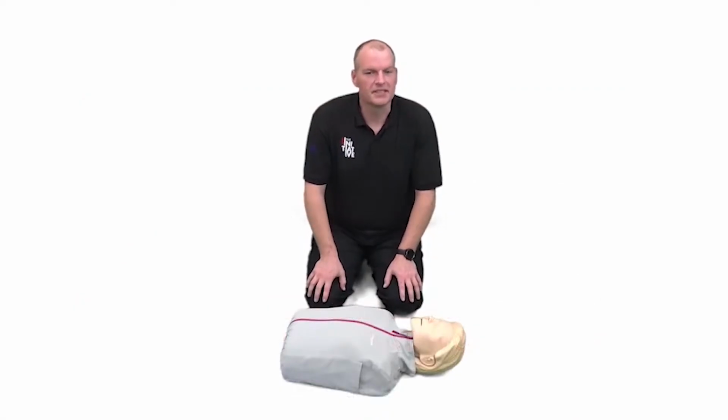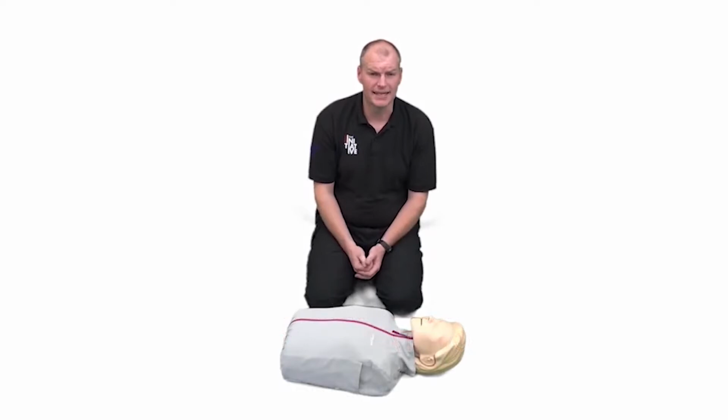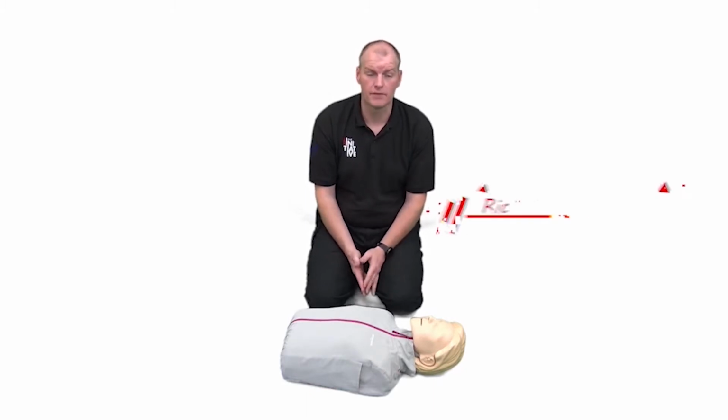In this module we will look at how to perform cardiopulmonary resuscitation on a casualty who is not breathing or not breathing normally, and how to use an automated external defibrillator. Having completed the primary survey and determining that our casualty is unresponsive and not breathing normally, we're going to have to start cardiopulmonary resuscitation, or CPR for short.